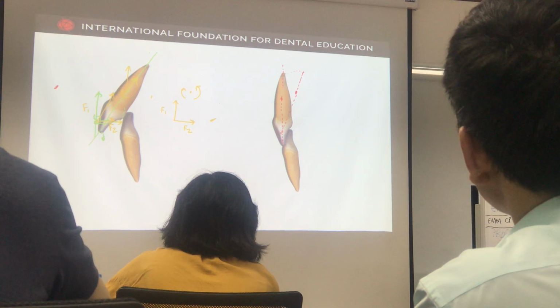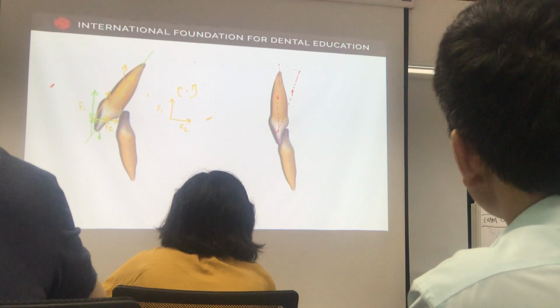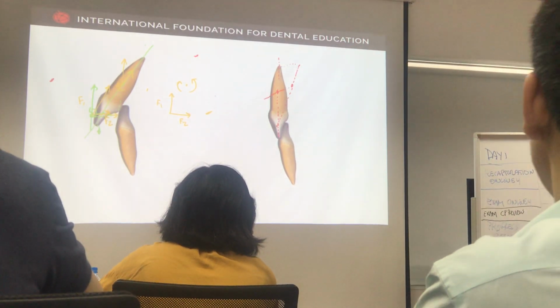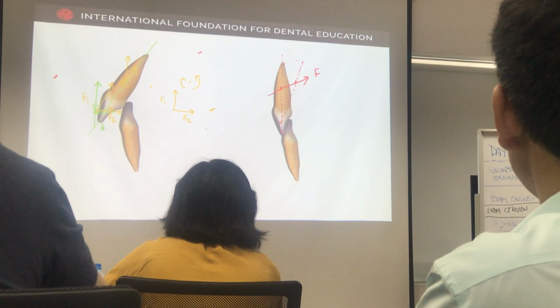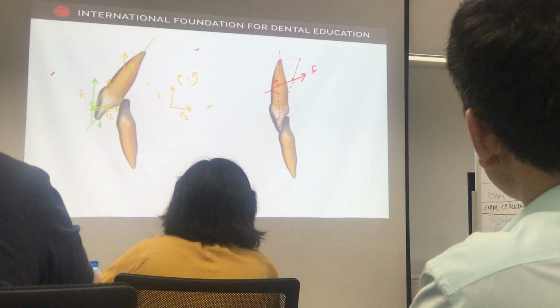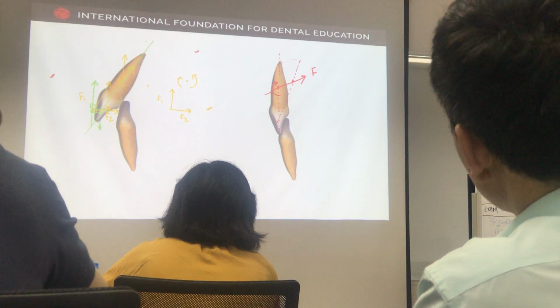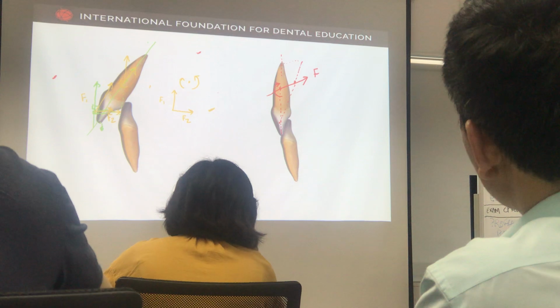So this time you want. Here. You want this force? Right. And you want what? This one. This is the force system. That's always the way you start the treatments. You find the force system, then you find the mechanics, not the other way around.